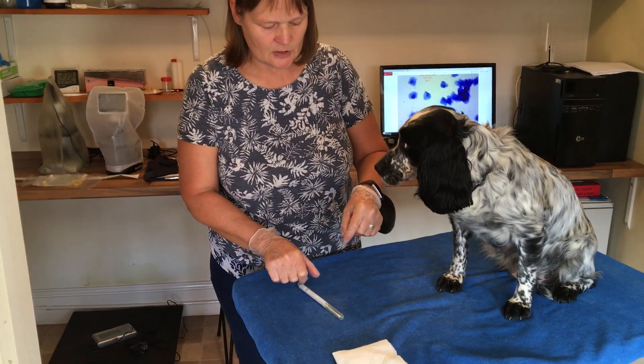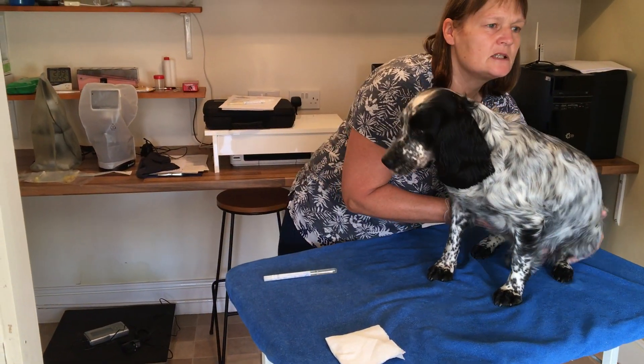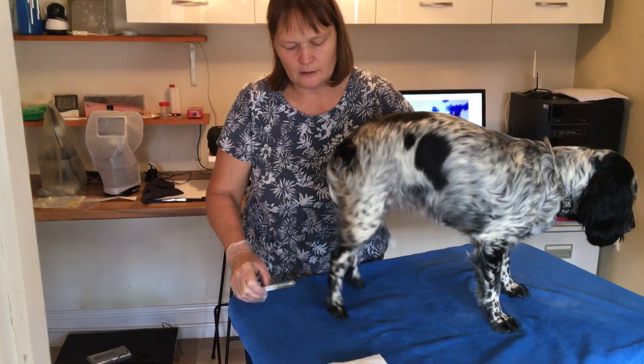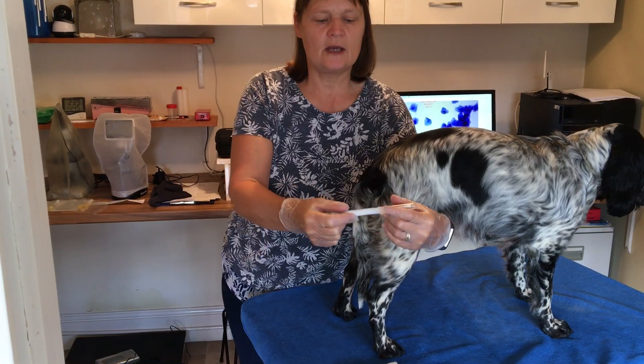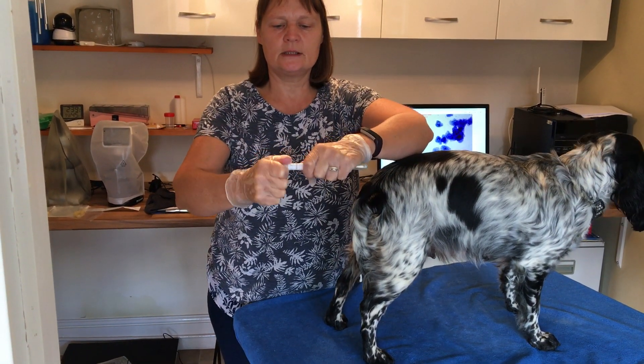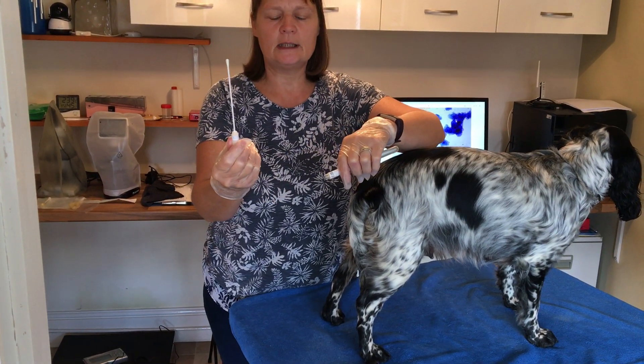I've got Bingo today just to demonstrate for you. Let me just get her in position. These are the sterile swabs that you get, totally enclosed. What you need to do is twist the top just to break the seal and then it comes with a little handle. That's totally sterile.